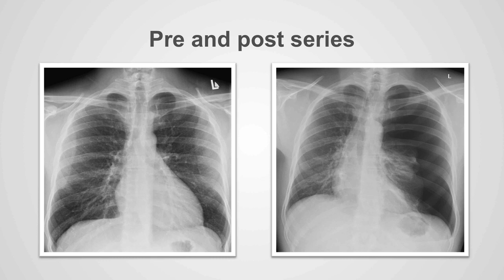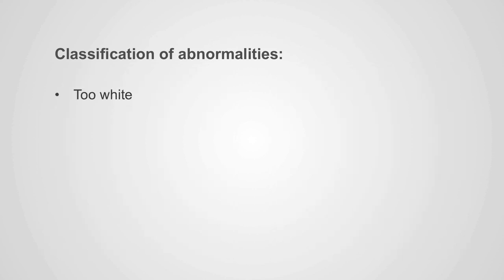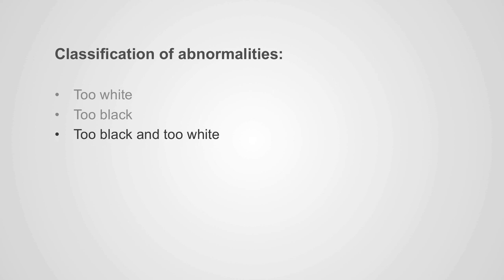In this case, we see that it is too black within this hemithorax compared to the normal x-ray. The reason for that is because the patient has a pneumothorax. Because the heart and mediastinal structures are shifted to the right, this is classified as a tension pneumothorax. So in recap, the abnormalities within the thorax can be classified as too white or too black. The pathology can also be both too black and too white, and that will be explained in a future video.